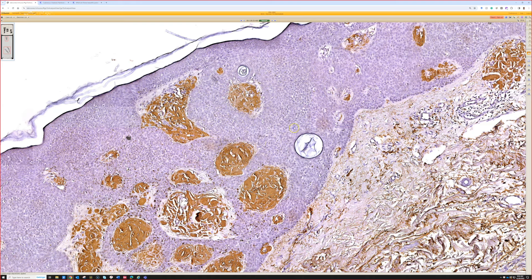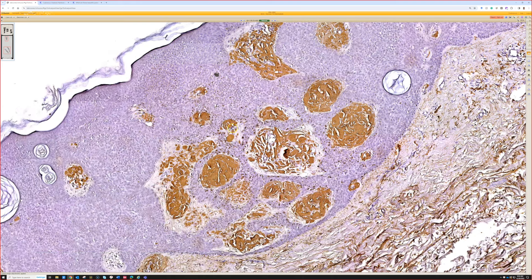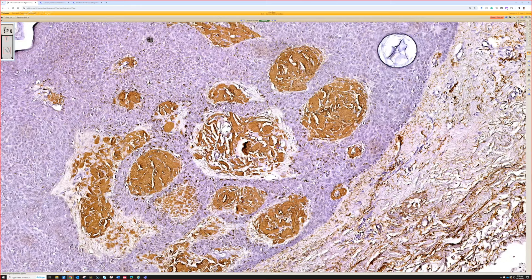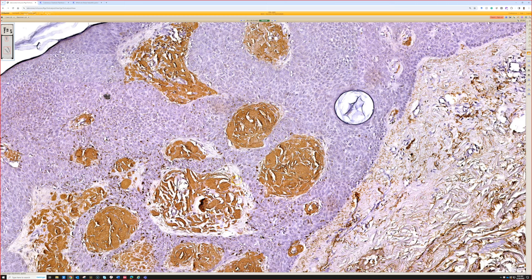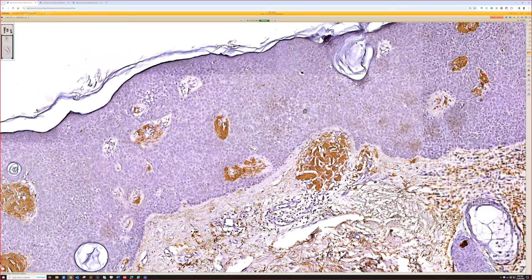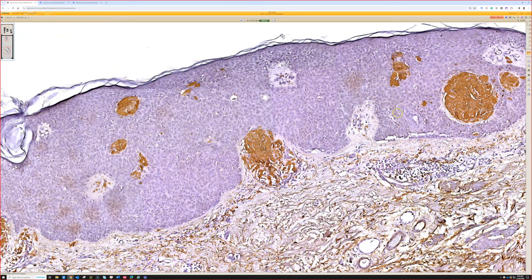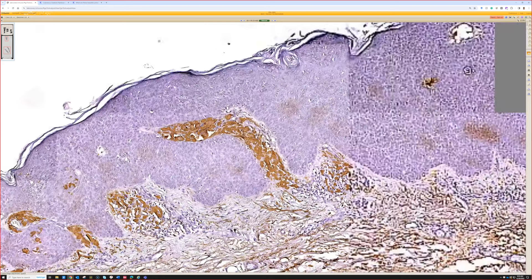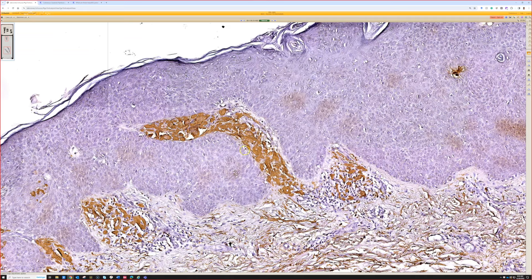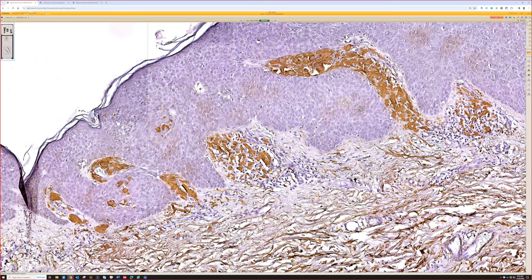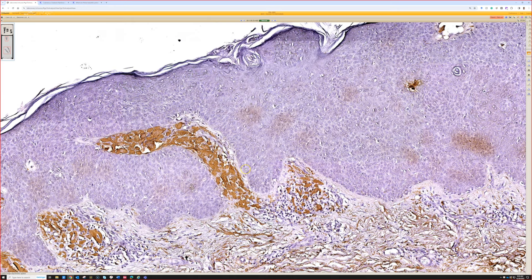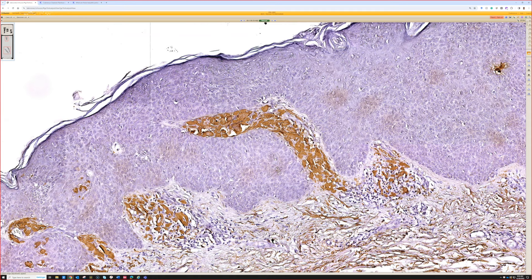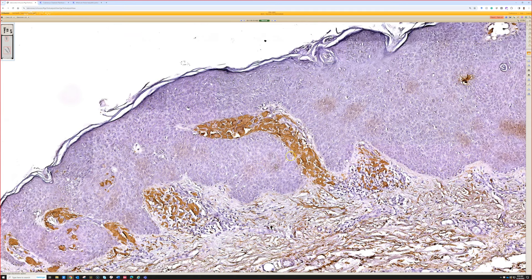My favorite stain is thioflavin T, which will beautifully stain amyloid — light chain amyloid, keratin-derived amyloid, and other amyloids — bright green. But you need a fluorescent microscope to view it. The amyloid P stain looks really nice in this case, so maybe I should give it another try. As I mentioned, some keratin immunostains will focally stain keratin-derived amyloid — particularly cytokeratin 903 tends to work really well. I've tried cytokeratin 5/6, another high molecular weight keratin, and it worked focally but not as well. Pan-cytokeratins like AE1/AE3 did not work well in my hands for keratin-derived amyloid.